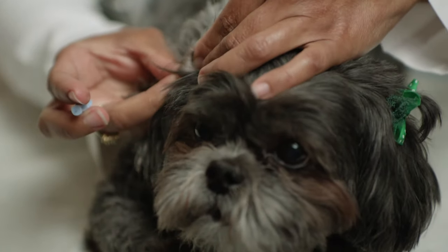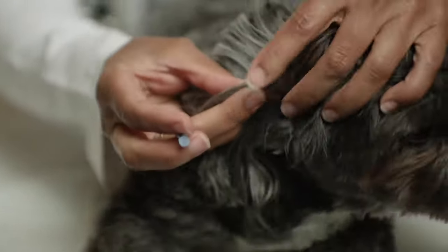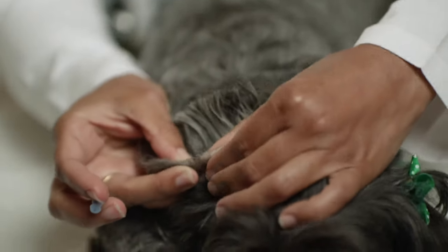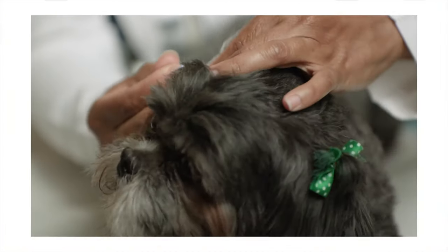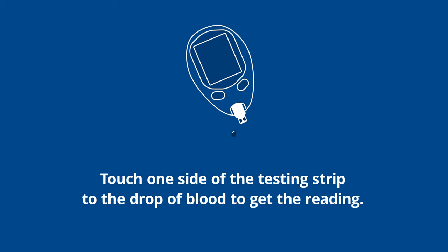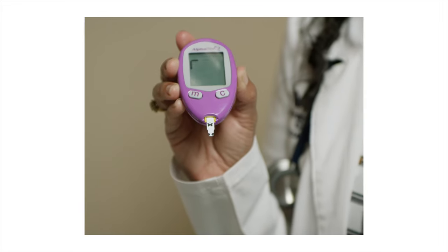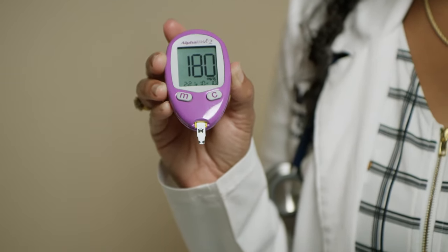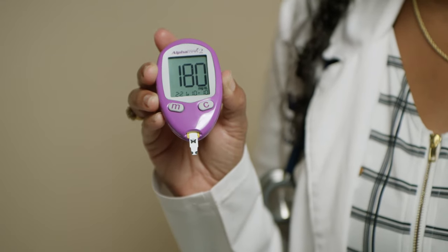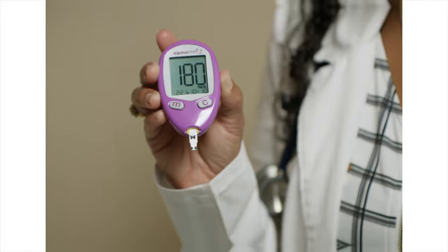We will collect a blood sample from Izzy's ear. Sometimes you can use a warm cotton ball or warm cloth to help stimulate blood flow. Your glucometer will beep twice when the sample is ready, after having beeped once when the sample has been obtained.